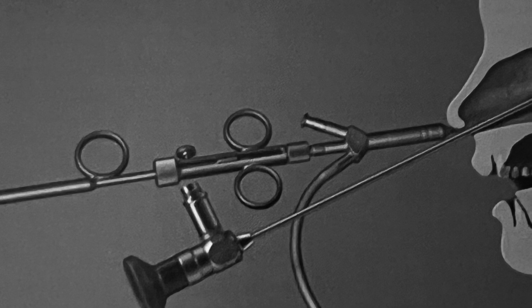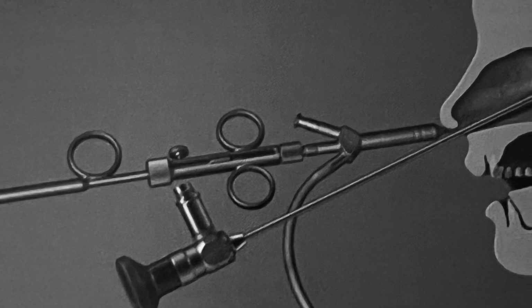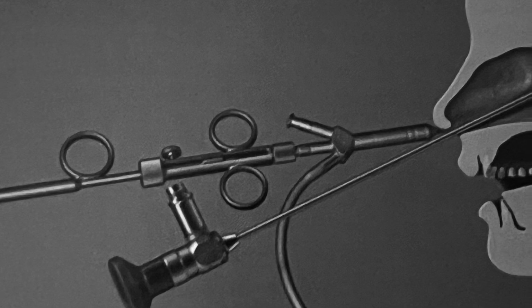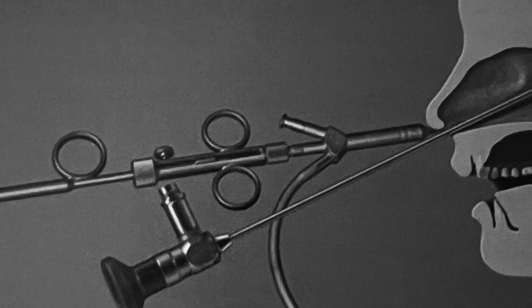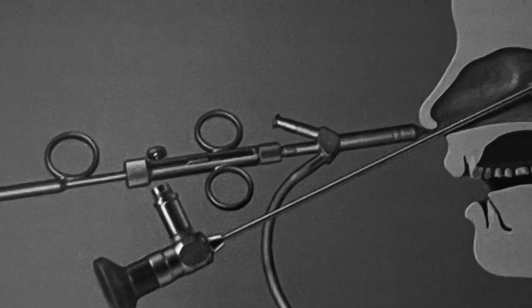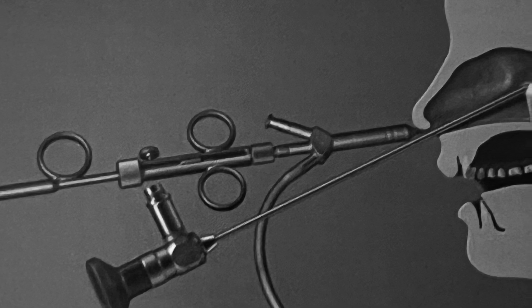BDET is recommended for chronic obstructive ETD lasting more than 3 months despite medical treatment, recurrent otitis media with effusion in adults, barotrauma affecting divers, pilots, and frequent air travelers, persistent ear fullness, tinnitus, or hearing loss from ETD, and candidates for middle ear surgery needing optimized Eustachian tube function.